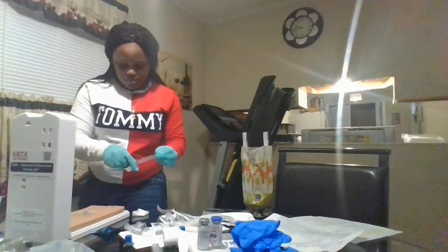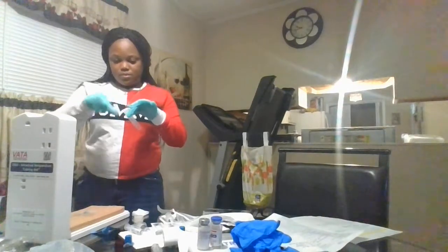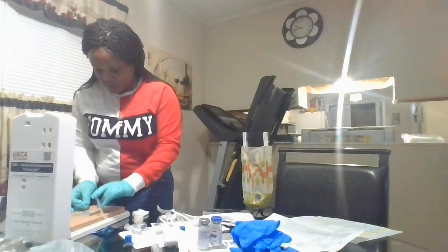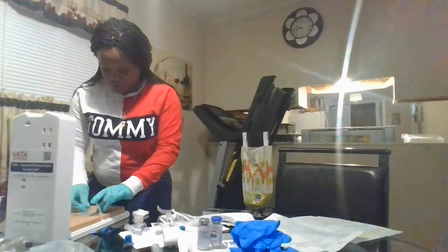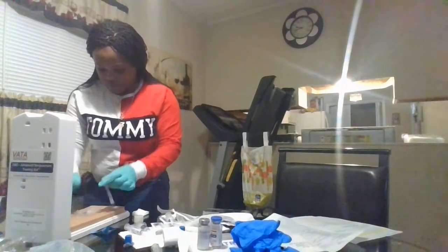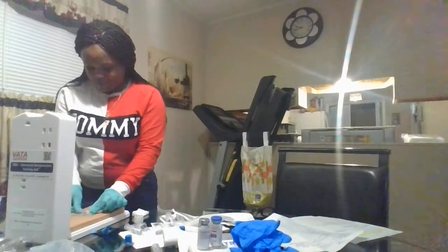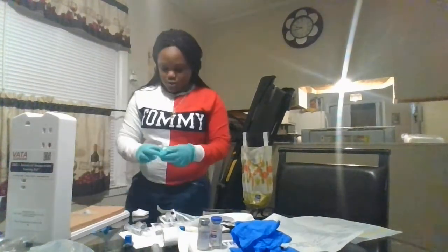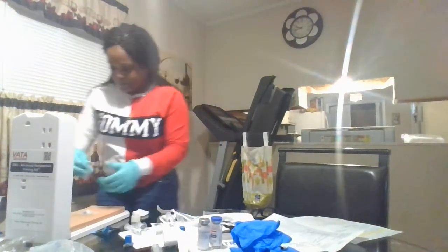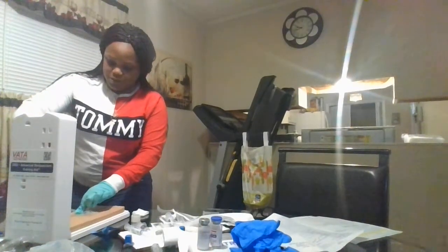And I'm going to chevron over. Your skin is so oily, Mr. Jack. Then the last one, I'm going to secure my flush. All right, pulling back, aspirate on my flush to make sure we're still in.